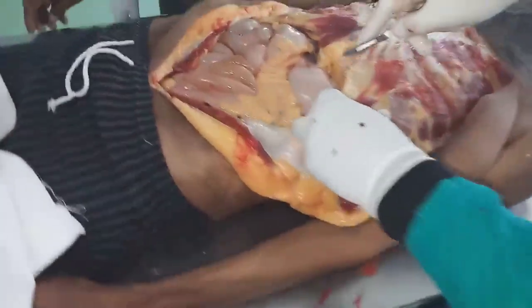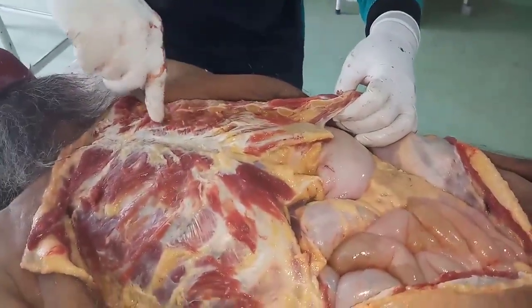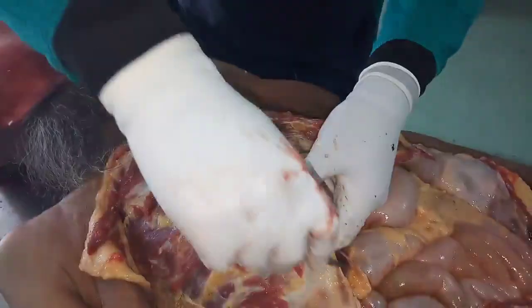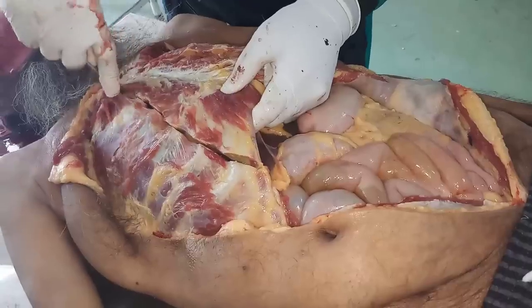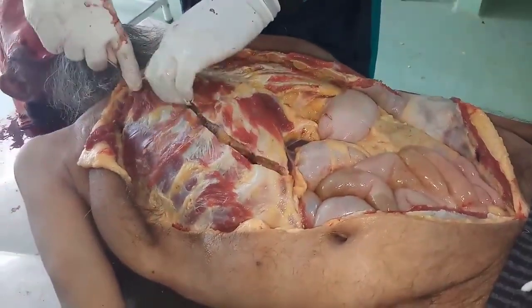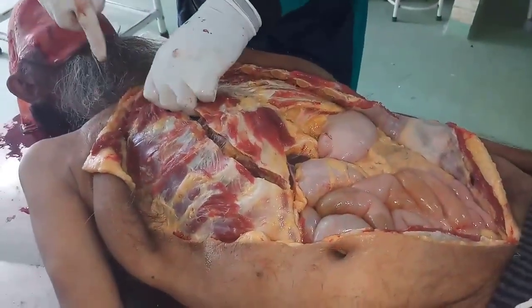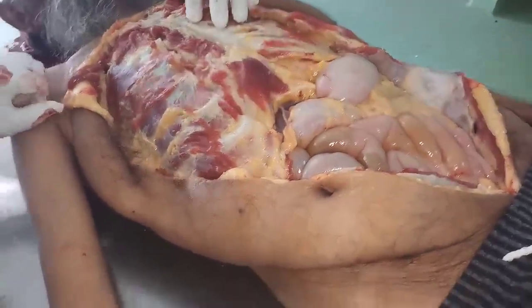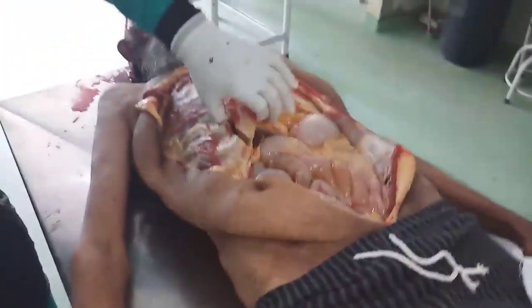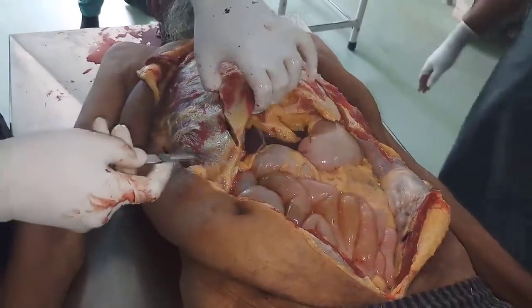Now I am going to cut the costal cartilage. See, these are costal cartilage. I am going to cut costal cartilage on this side. Now on this side, these costal cartilages are cut. Now we'll remove this sternal plate. This is called sternal plate because it bears costal cartilage also.